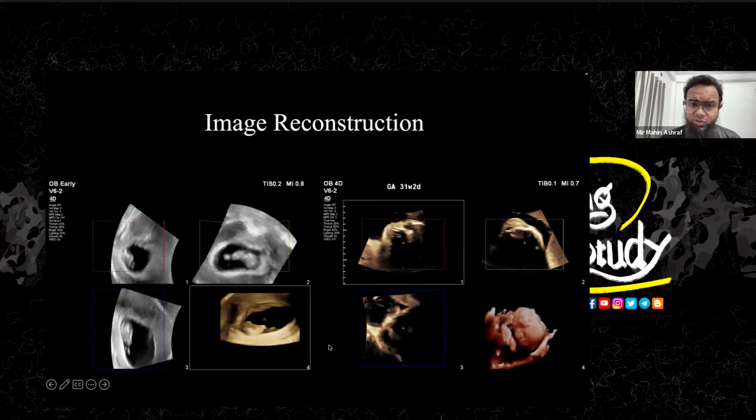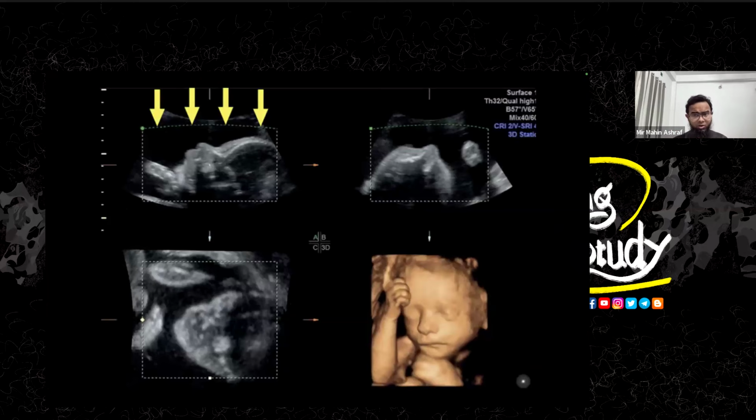So this is the image reconstruction. Like here, I have a tiny embryo. We have put colored 3D ultrasound. So we acquired all the data and displayed it as the image reconstruction. This is the reconstructed image, but this is the raw data, so it doesn't always look quite good. You need to adjust it a lot. We need to adjust it through many different functions. It needs a separate lecture, I think.